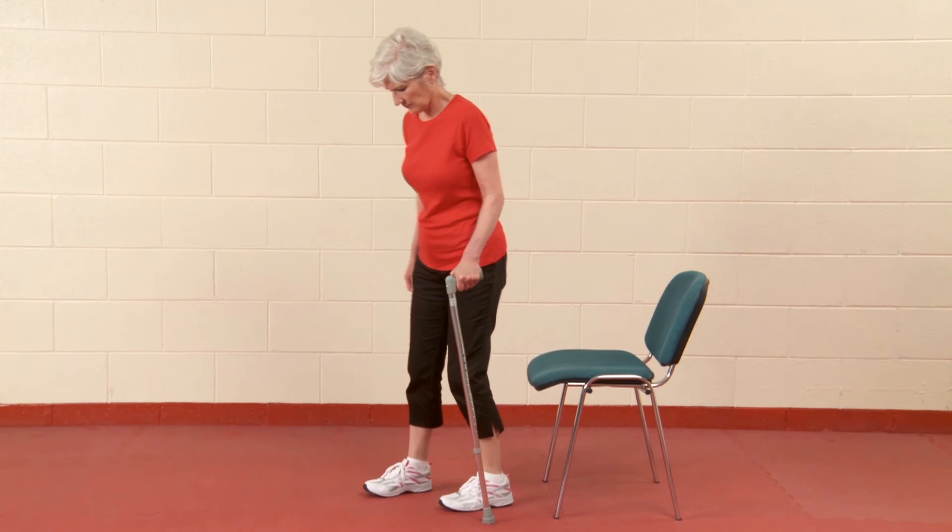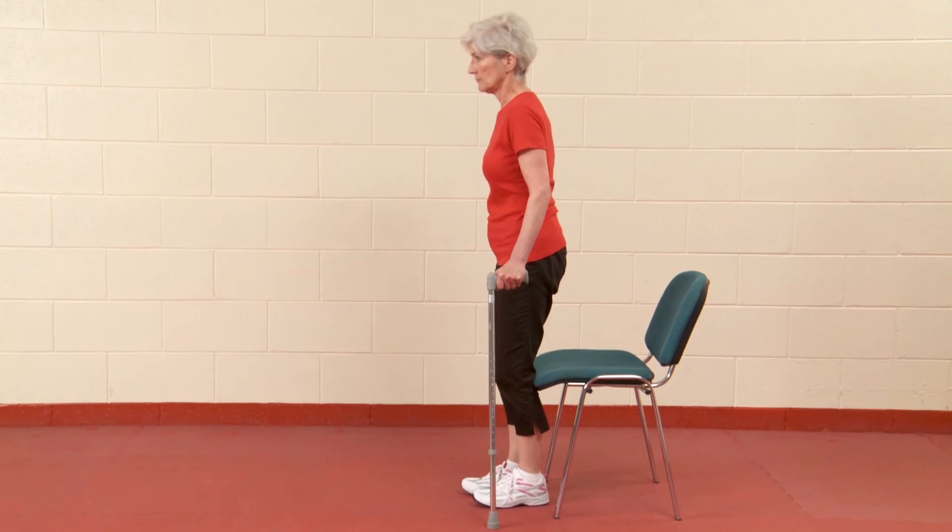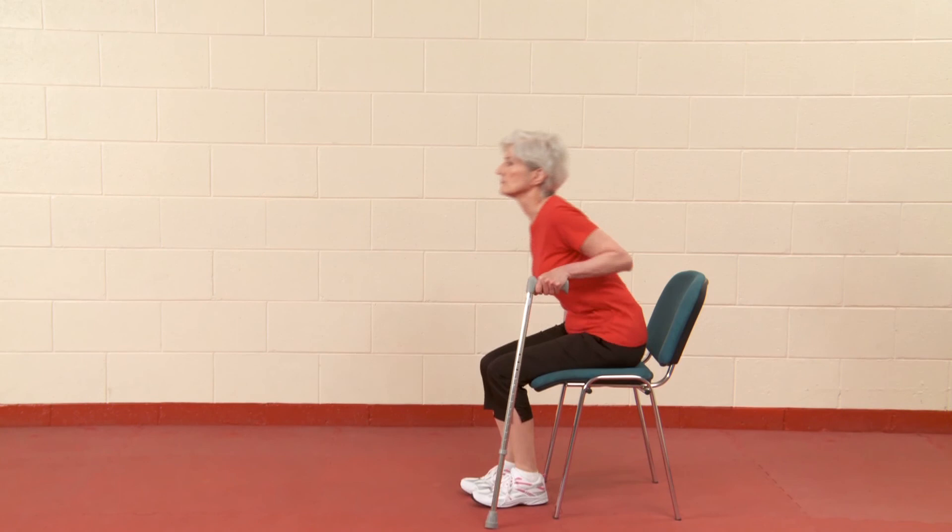When you come back to a chair, step back until you feel the chair at the back of your legs. Reach back to touch the chair. Sit down slowly.